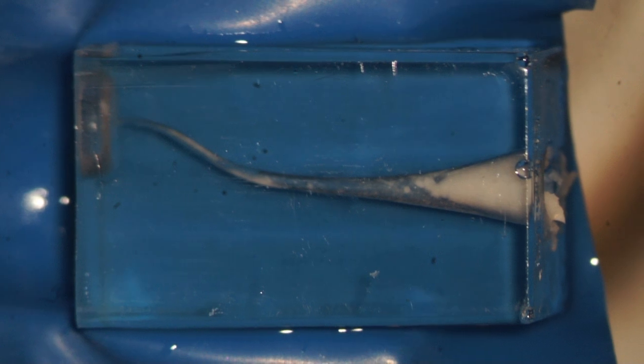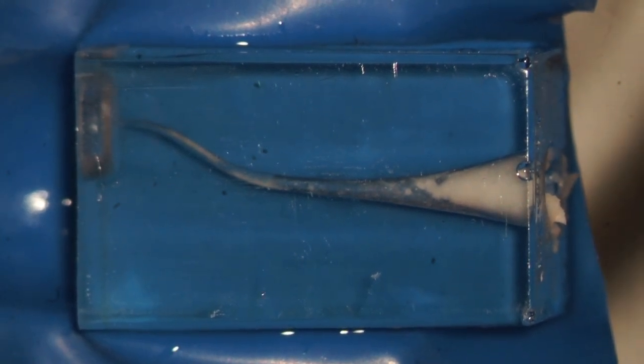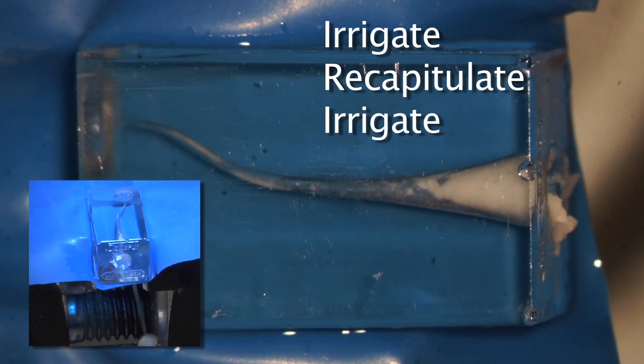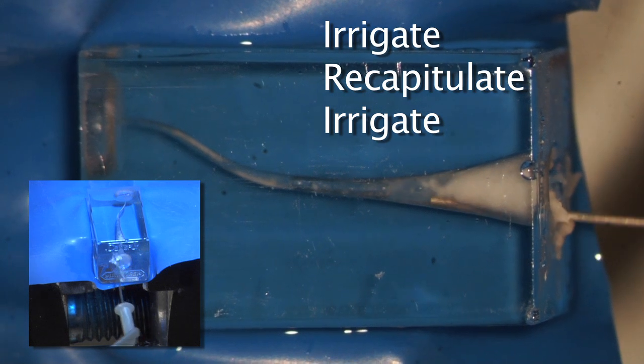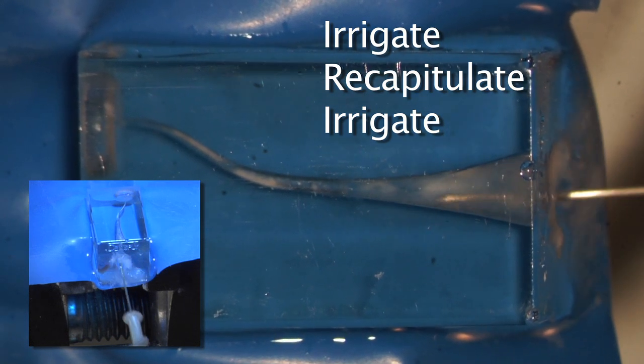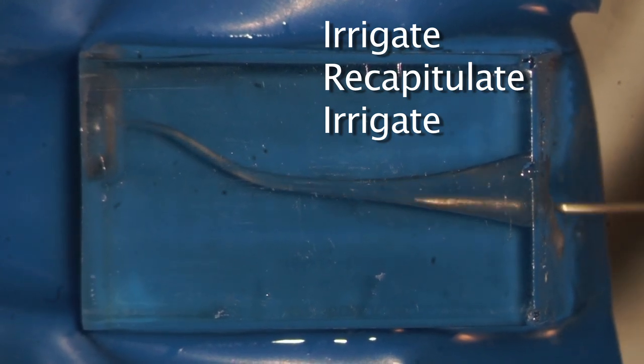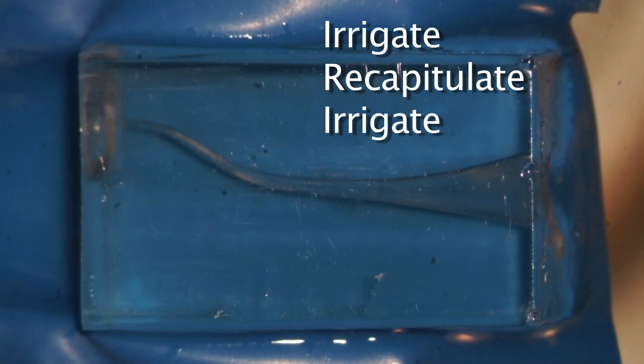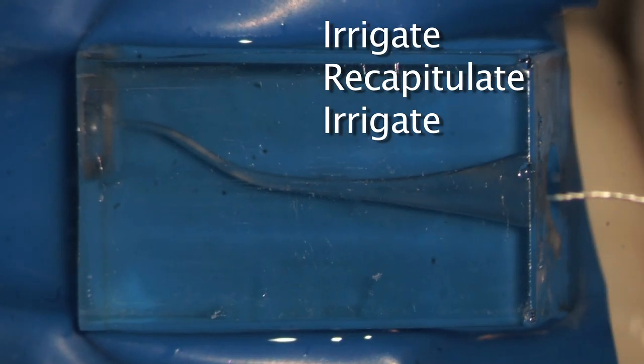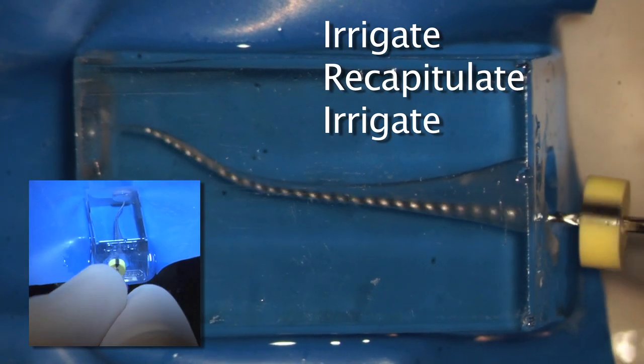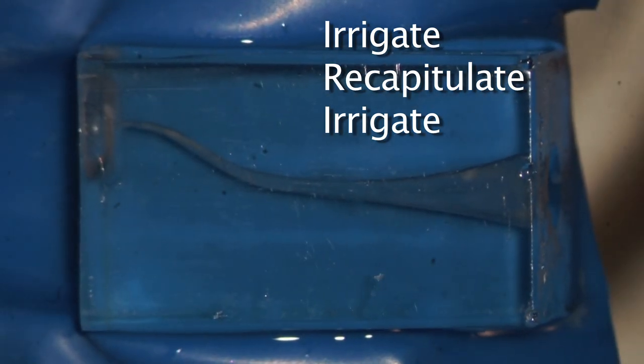So what did we talk about? We talked about all that debris. So after every single mechanical file, whether you think you need to or not, never miss the step of irrigating. Always keep your hand in motion when you irrigate so you never lock up the cannula and make the canal an extension of the cannula. That's how you get a sodium hypochlorite accident. I can vacuum a little bit and irrigate and vacuum and irrigate, but notice all that debris. Still see debris on those lateral walls. So let's just recapitulate with the ten file. The ten file can break up debris. It can move that debris into solution. And now it's loose, and now we can re-irrigate, and we can kick out that debris.